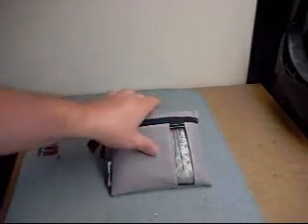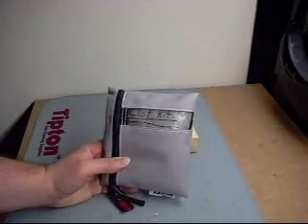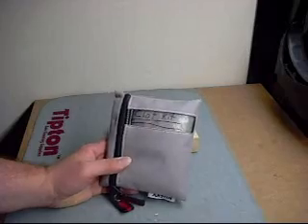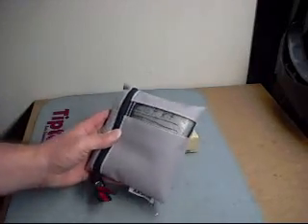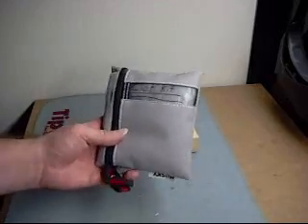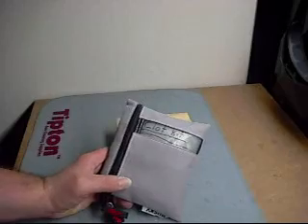And I really like the window because if somebody that's not familiar with your gear has to retrieve your first aid kit, if they see first aid or something written on something inside it, they're like, okay, Clot Kit, or first aid kit, or whatever you want to write on it. It really works out well.